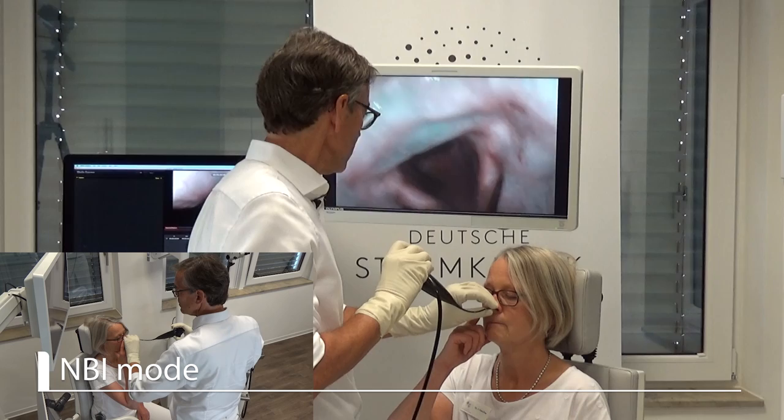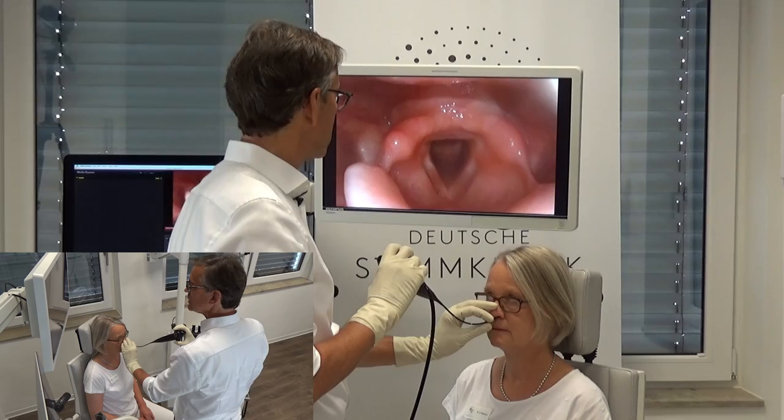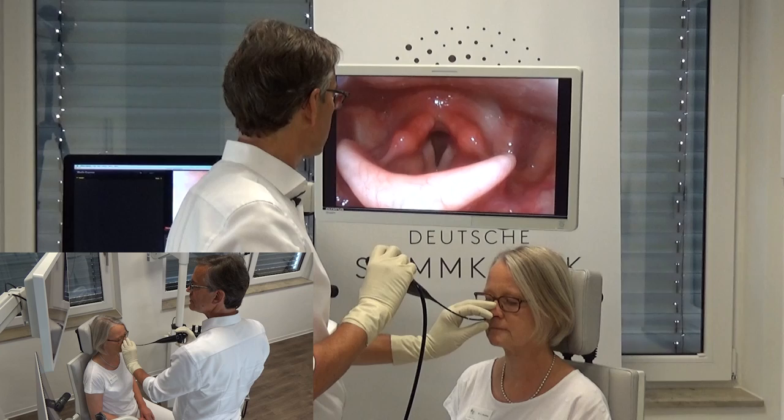And once more, and once more in the NBI mode. And exhale. And maybe also cough as a cleaning mechanism — cough once, yes — and swallow once more.